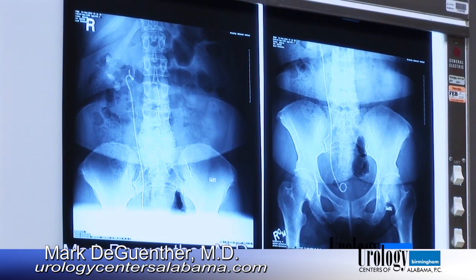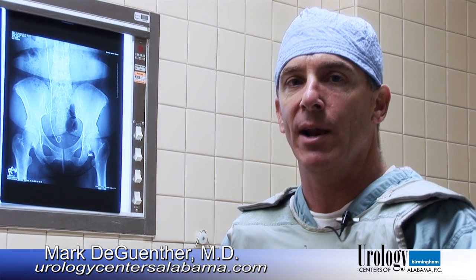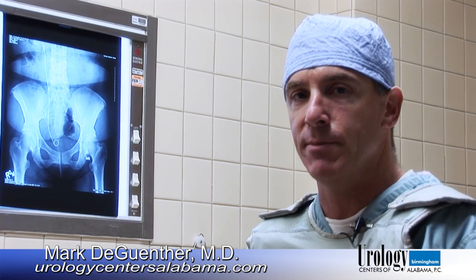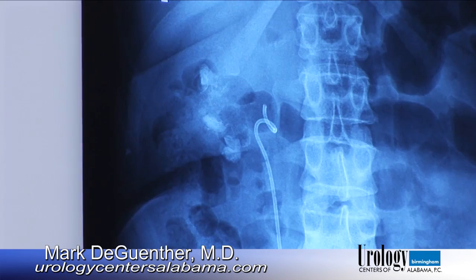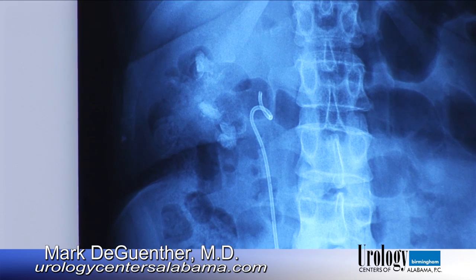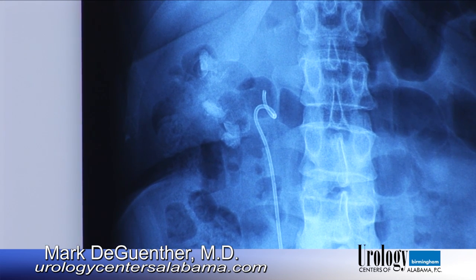A stent is used to prevent the urinary tract from being obstructed by large stone fragments. Sometimes a stent is necessary during a lithotripsy, as we call this procedure. Sometimes it is not. Generally, if there is a large stone greater than about half an inch or so, we will need to place a stent. Otherwise, we can do this procedure without a stent.